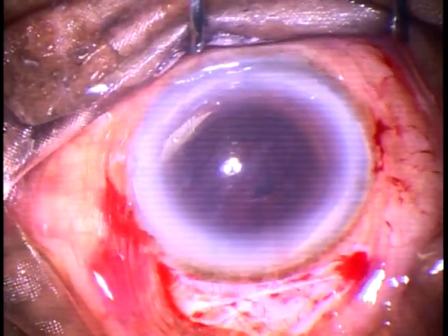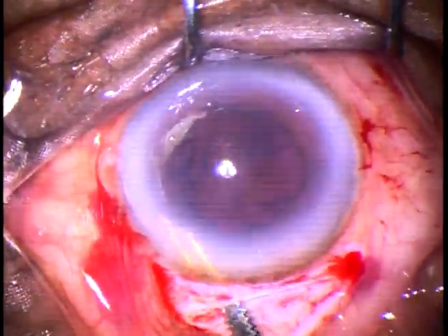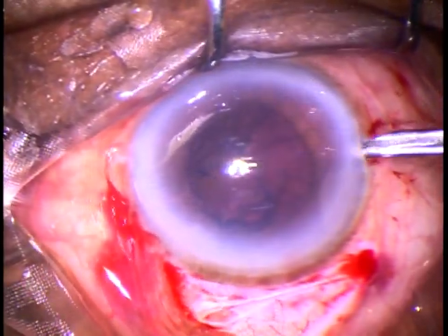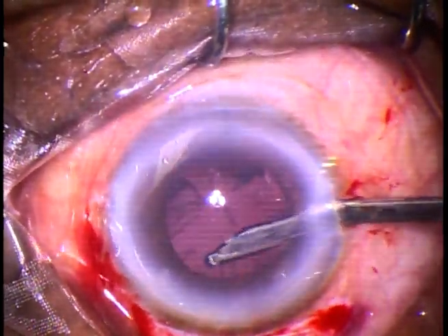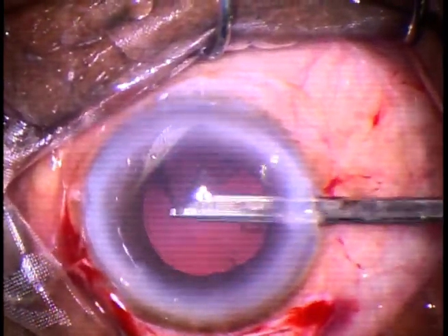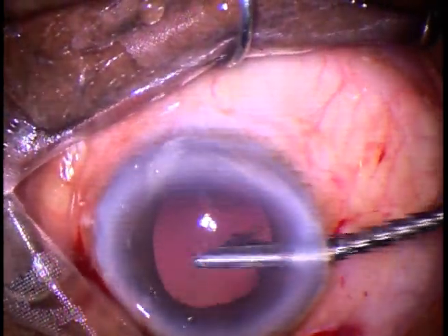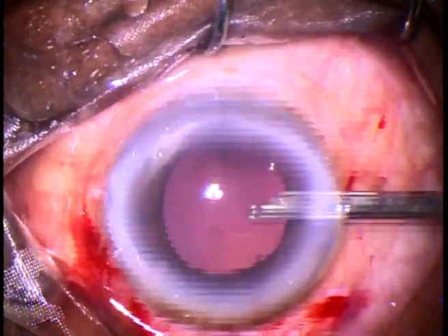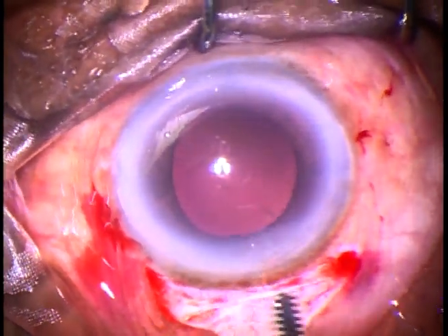And now, we have to remove the cortical matter. First, irrigate some fluid towards the cornea, because some cortical matter sticks to the cornea. If it gets dislodged, visibility improves. And now, I am removing the cortex going through the side port. In this case, I could remove the whole cortex going through the side port. This is the sub-side port cortex — I'm trying to hold it. Yes, I could hold that and remove it. So, cortical matter has been removed. This is a chunk of epinucleus — it has come out.